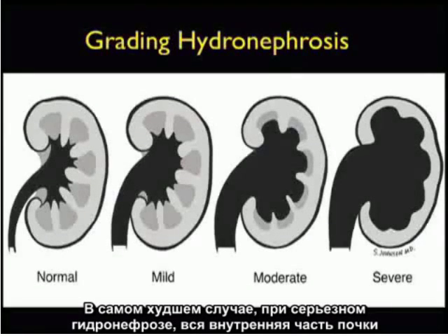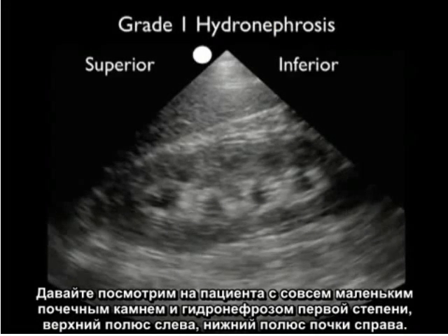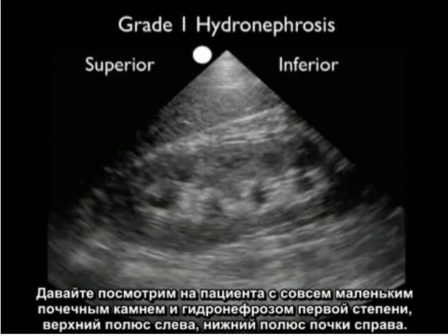In a worst case scenario, in severe hydronephrosis, the entire inner part of the kidney is shelled out by fluid, and all that's left is a little rim of the outer cortex around all the fluid within the hydronephrotic kidney.